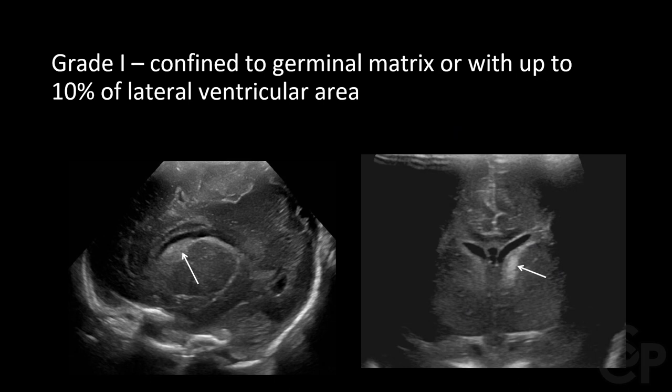Grade 1 is confined to the germinal matrix or with up to 10% of the lateral ventricular area. The sagittal view shown on the left confirms the hemorrhage is confined to the germinal matrix. The coronal view on the right indicates this is one-sided, making it grade 1 and asymmetrical.